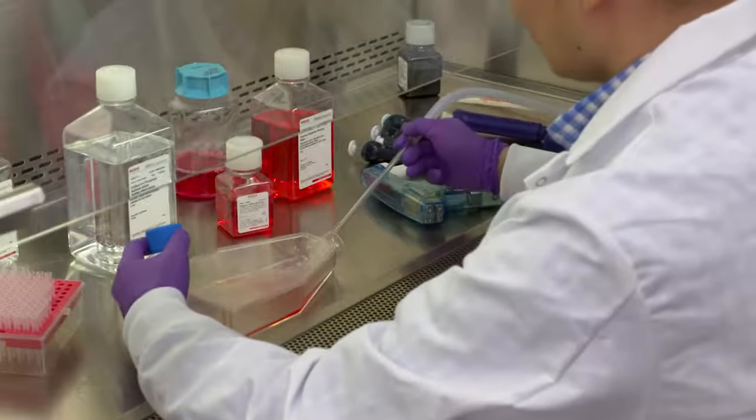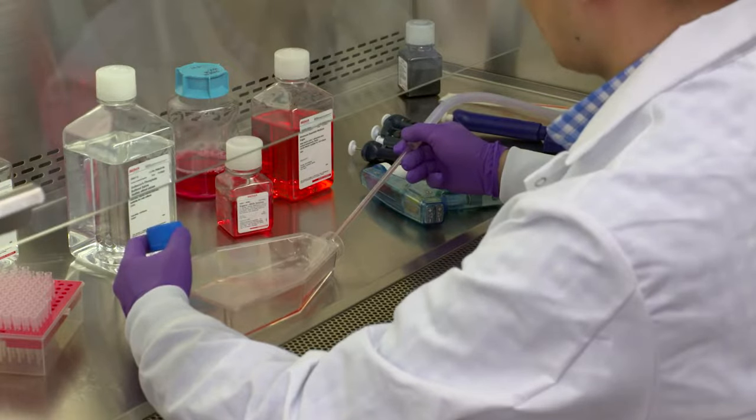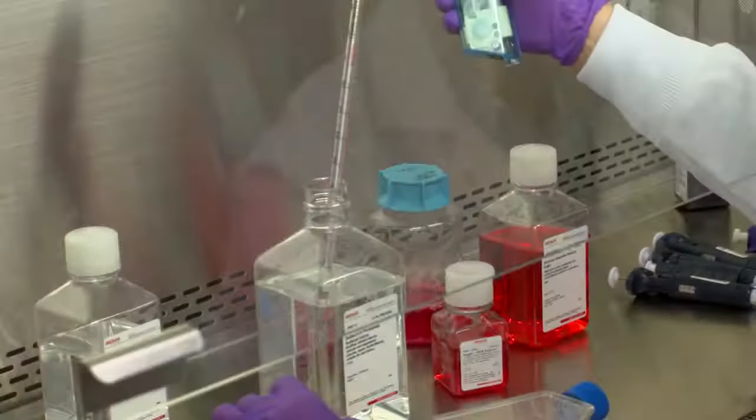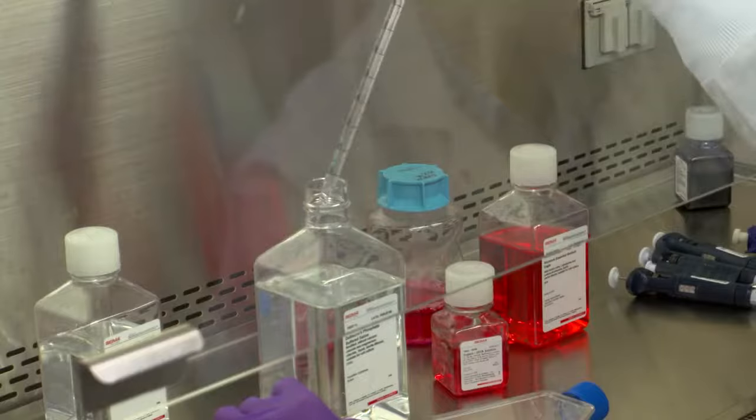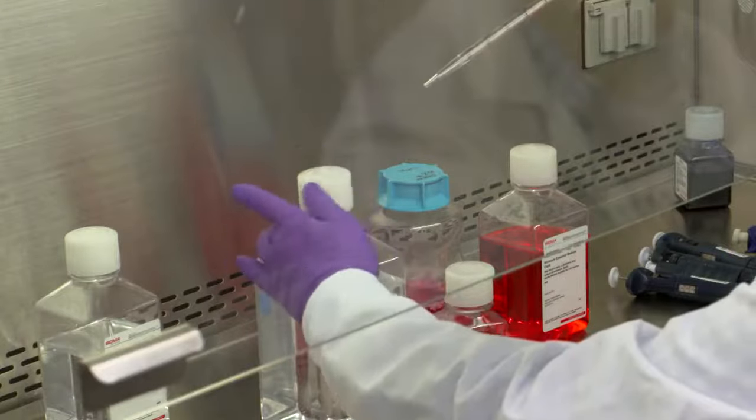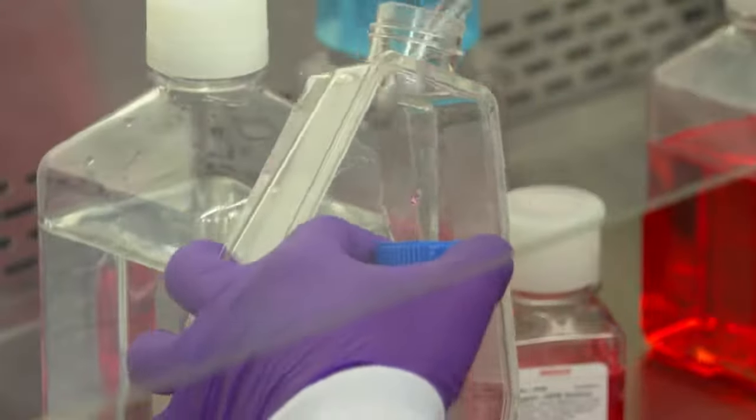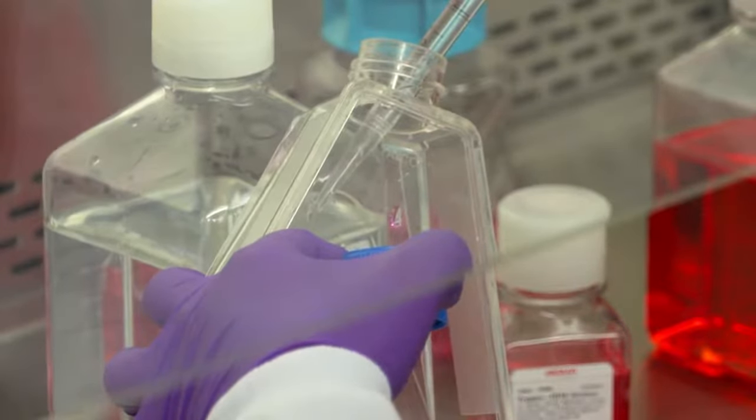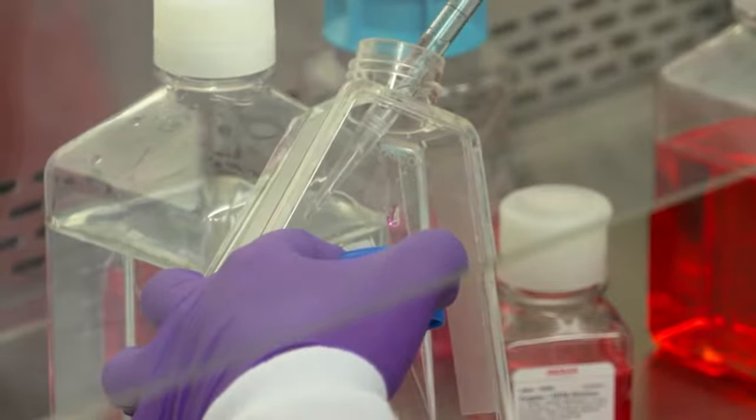Place the flask in biosafety hood. Remove the media and gently wash the cell monolayer with room temperature PBS or HBSS. Carefully add PBS to the side of the flask as to not forcefully dislodge adherent cells.